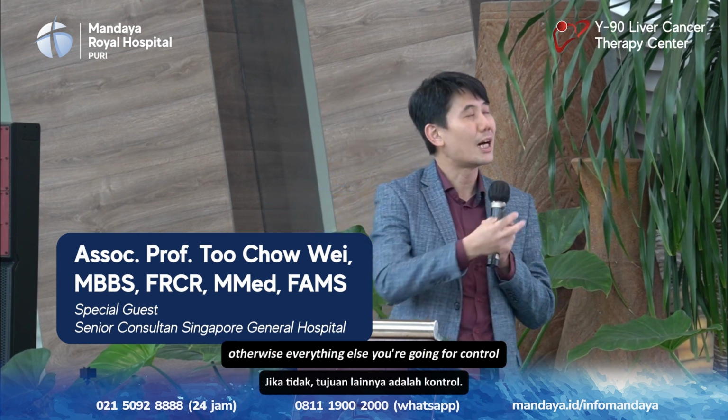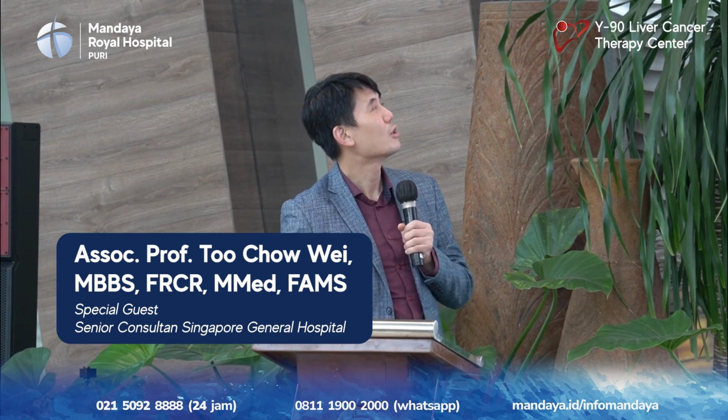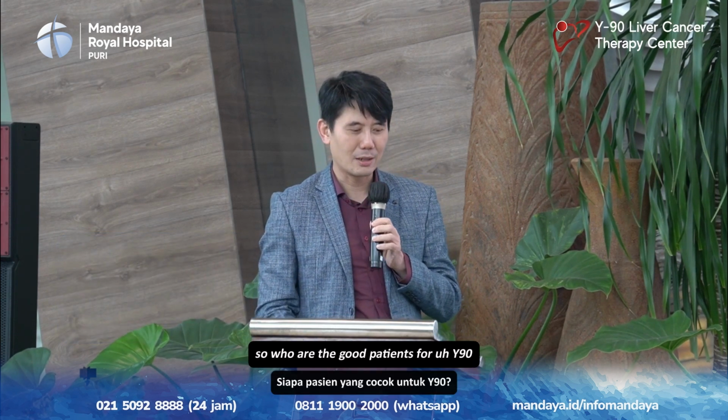Treatment intents: number one, it is radiation segmentectomy if you want a cure, or you're bridging to transplant, or downstaging to resection. Otherwise, everything else, you're going for control. So who are the good patients for Y90?